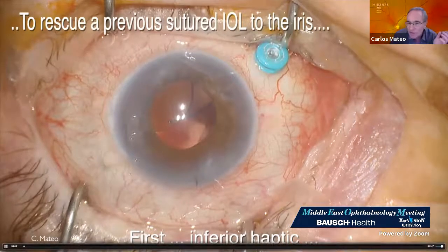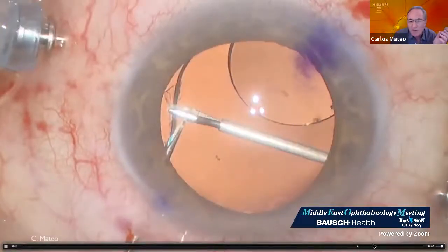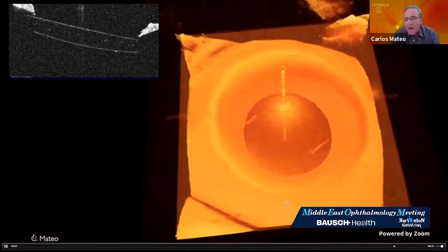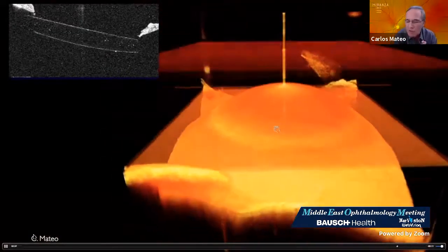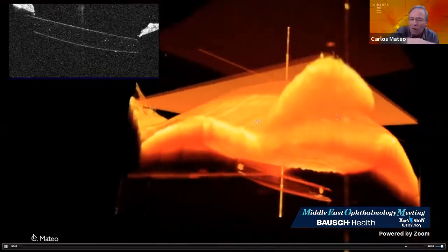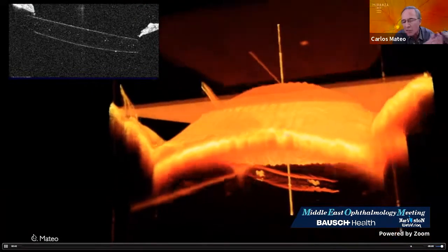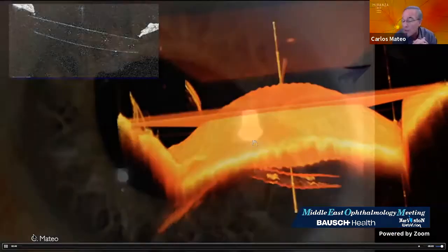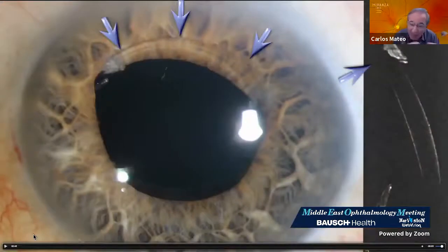tilting effect. The tilted. Look at this in this patient. This is a patient I did the same, and at the end, perhaps technical issues, but the lens was not so well in position, and at the end the patient showed the capture of the lens in the superior part of the iris. And for me, the tilting is sometimes difficult to manage in the Yamane technique. And you have to remember, not all lenses are the same for Yamane technique.